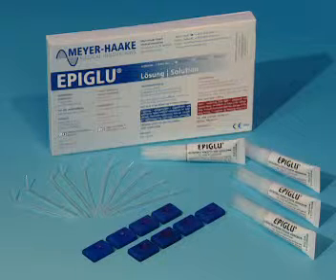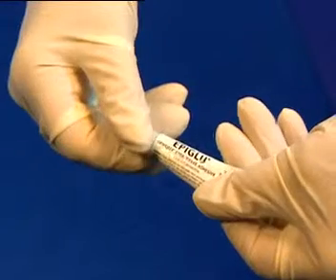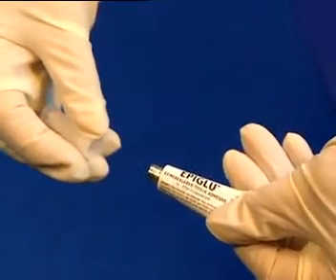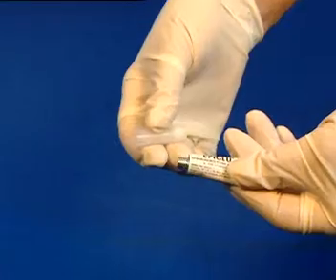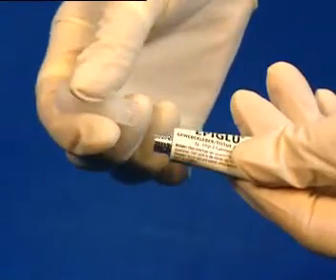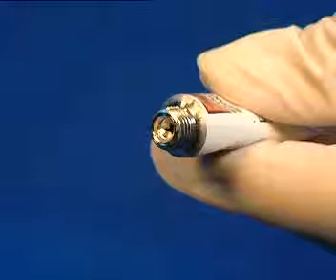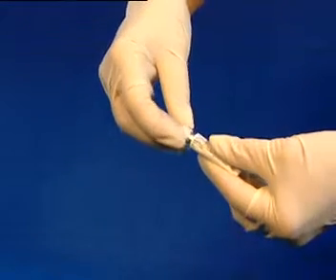Only one tube is opened at a time. The content is sufficient for at least 20 applications with several layers. The tube cap has to be unscrewed completely. Unseal the tube by punching the tip of the cap into the seal. Screw the complete cap on again and remove the upper cap. Epiglu is now ready to use. Avoid squeezing the tube during the opening process.